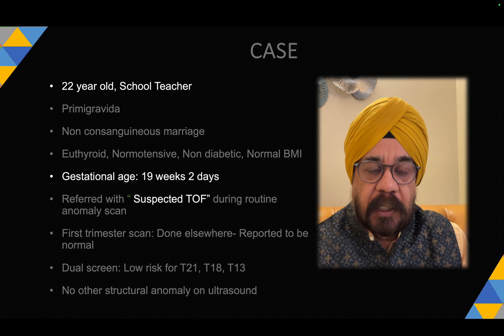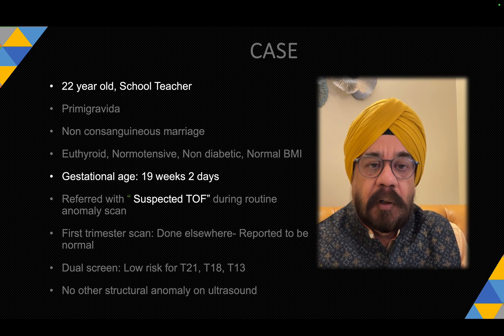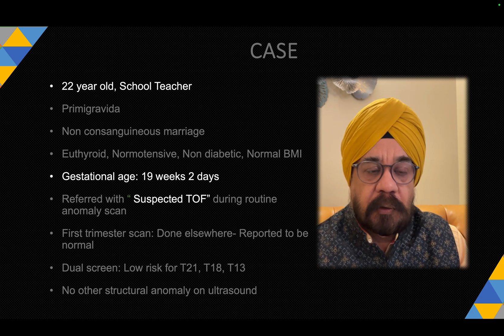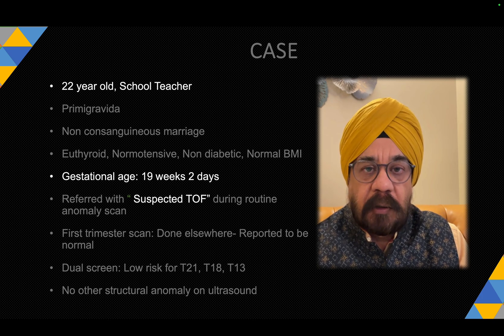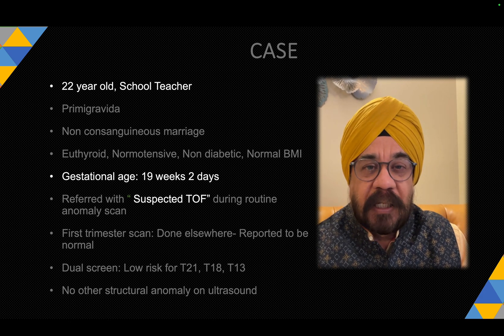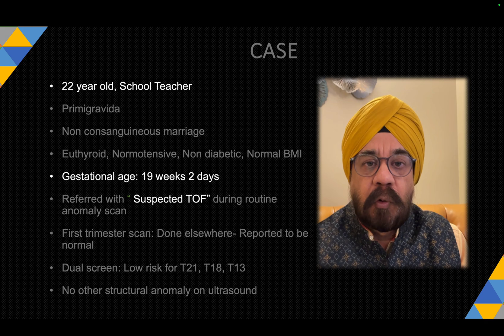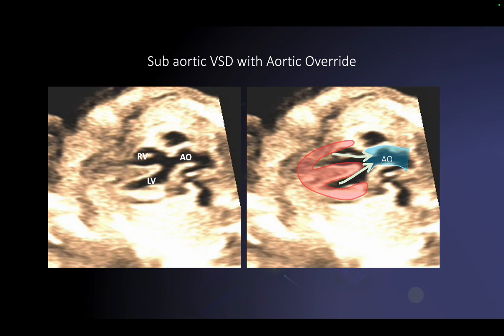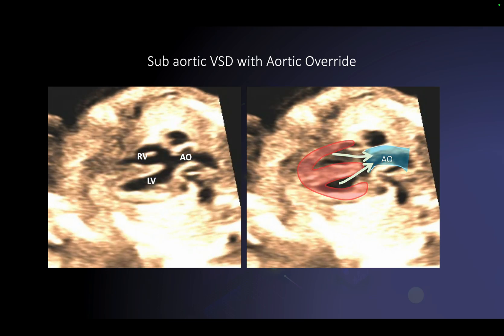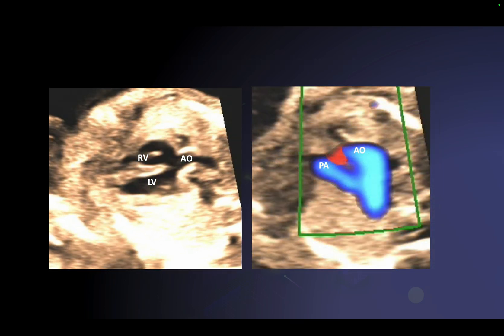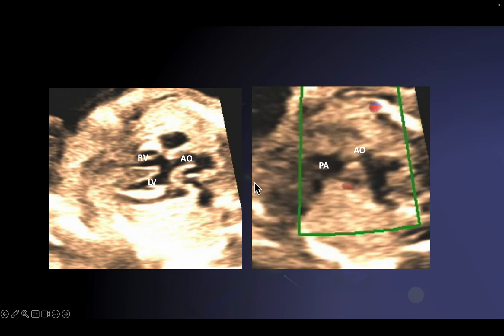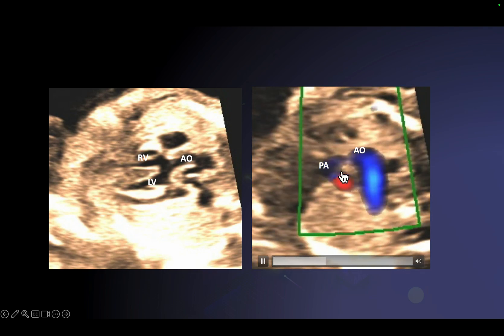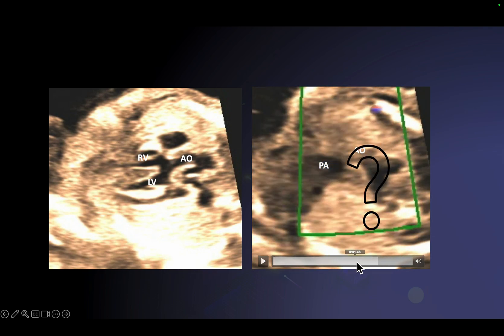This is a school teacher, 19 weeks of gestation, referred for a fetal echo with suspected tetralogy of Fallot. You guys are picking up tetralogy and sending for further assessment - that's today's discussion. This patient had an aortic override - you can see the blood from both RV and LV entering into the aorta. On the three-vessel view you see the pulmonary artery is small; it's not making a V, it is making a T. And there is something called the question mark sign.